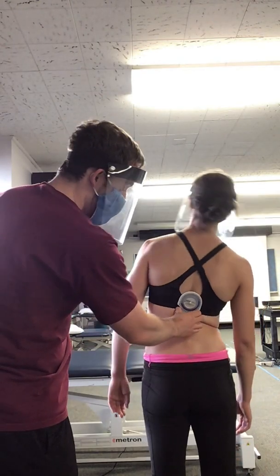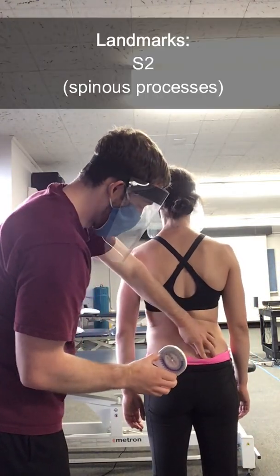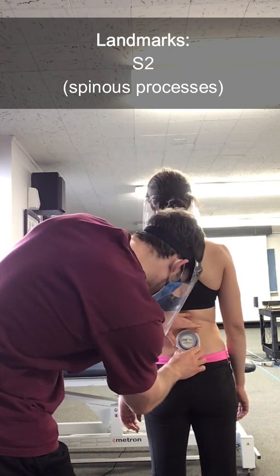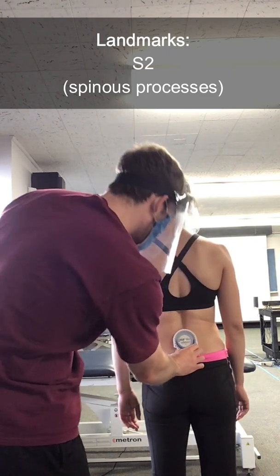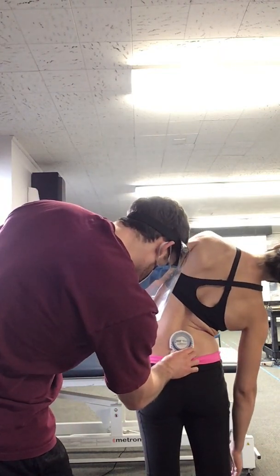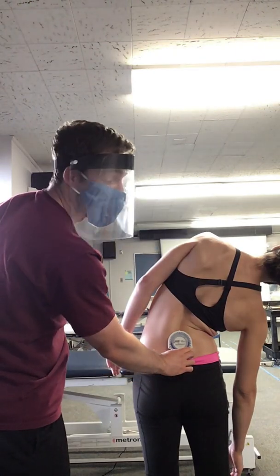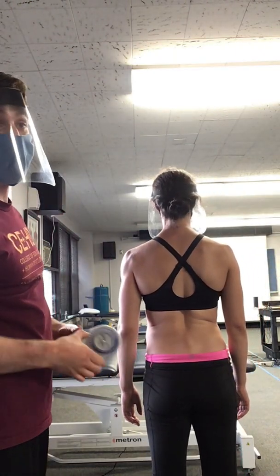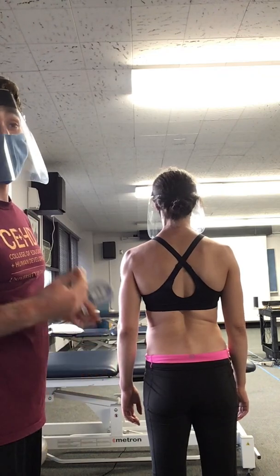And you can come back to the start. And then I'm going to find the PSIS, going right over the S2 spinous processes. Make sure it's zeroed out, and I'm going to have you bend to your right. And we're getting about five. Same thing as before — 35 on the top, five on the bottom — subtracting the two, and that's giving us 30.